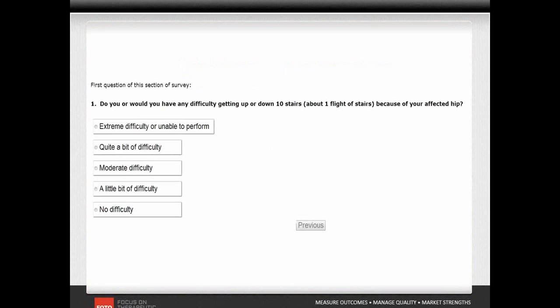This is an example of the way the screen appears during the patient assessment, creating a user-friendly interface, asking one question at a time in large print. The patient simply touches his response and the system moves to the next appropriate question.